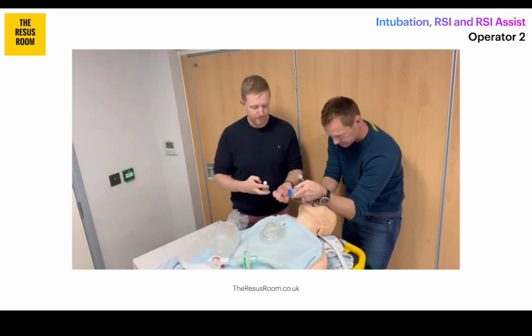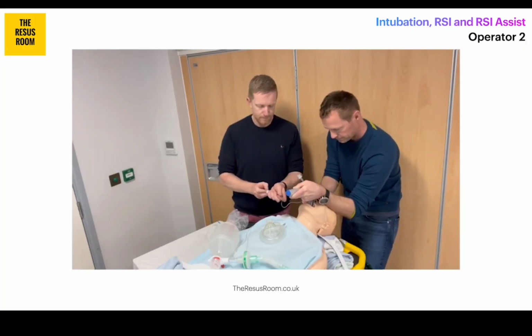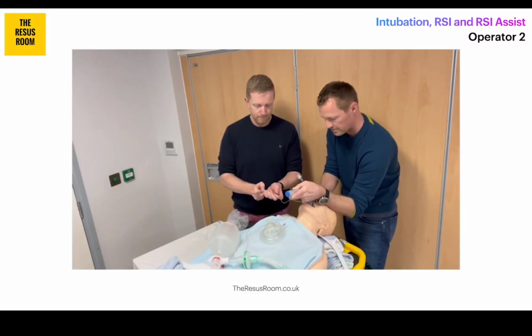Alrighty, so we're getting there now. The bougie has been removed. Simon inflates the cuff with around 6 to 7 mils of air, and then he's going to check the pilot balloon to ensure that it remains filled. If it's not and it's deflated, that might indicate a cuff rupture, which is a bit of a pain, and that means we need to reinsert a new tube.